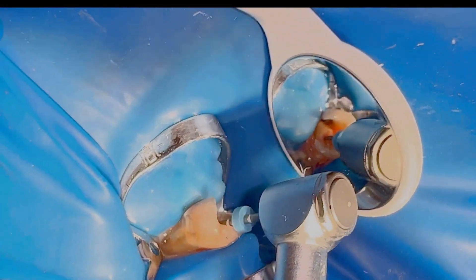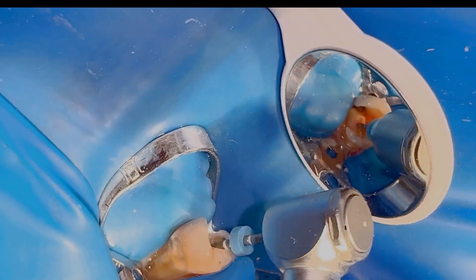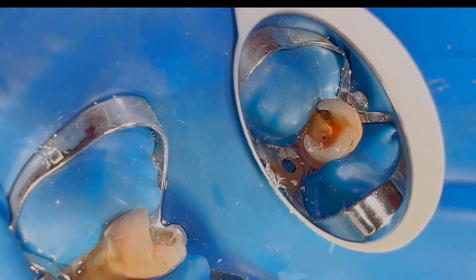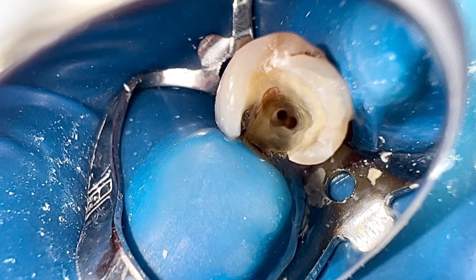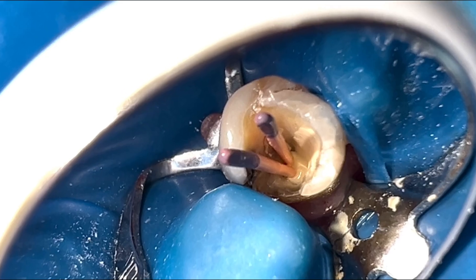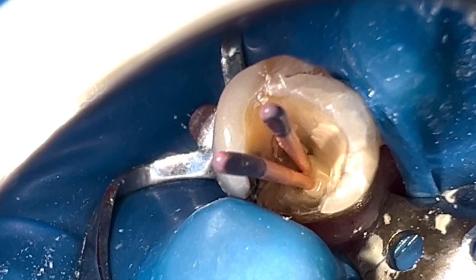In this case I use rotary files, but I recommend using files with shape memory such as HyFlex from Coltene. It is also important to use rotary files with little taper to avoid unwanted effects.